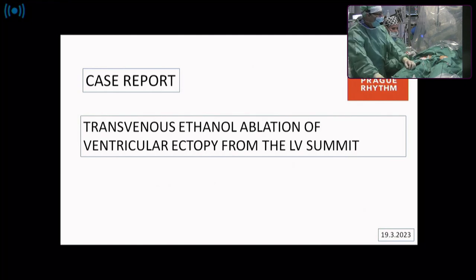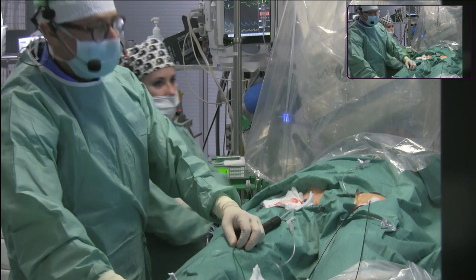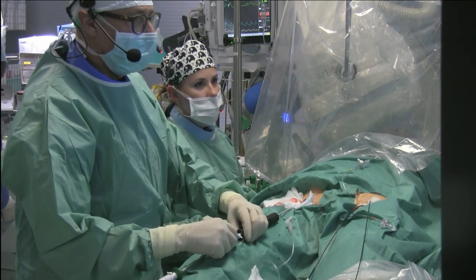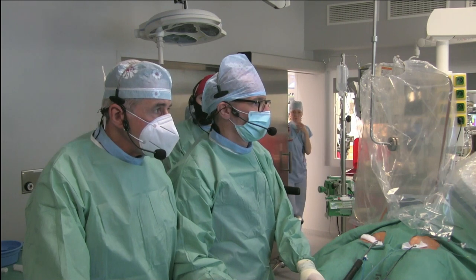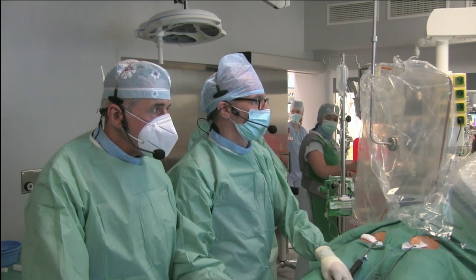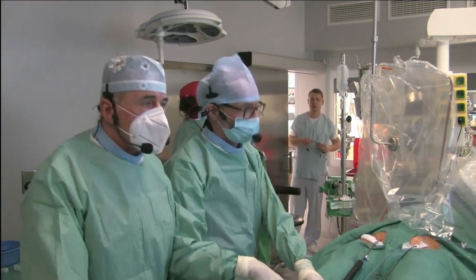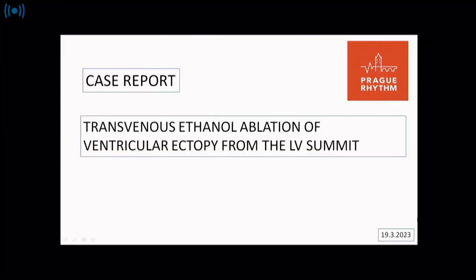Question: this patient has severe ventricular dysfunction - are you requiring any hemodynamic support or pharmacologic hemodynamic support under anesthesia? Now we are switching to the second lab. Hello, I'm here with Miguel and Jana. We have a patient with a previous failed ablation effectively from the LV summit.